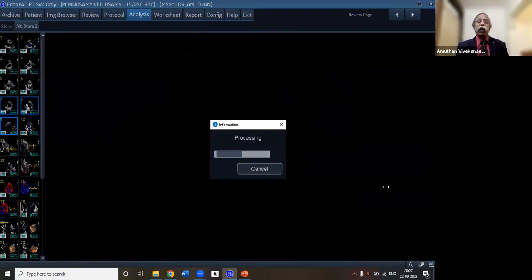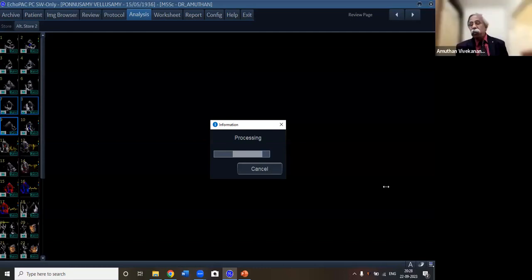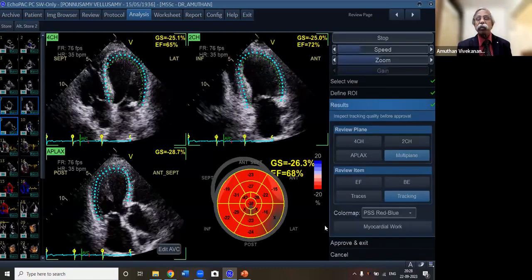So many of us have the wrong notion that strain takes a lot of time. It is so easy. I just recorded 3 beats: apical 4-chamber, apical 3-chamber, apical 2-chamber. Then just AFI, and then you are in. The processing takes only 2 to 3 minutes, and it doesn't take much of your time. You can see here. And see, the processing is complete.